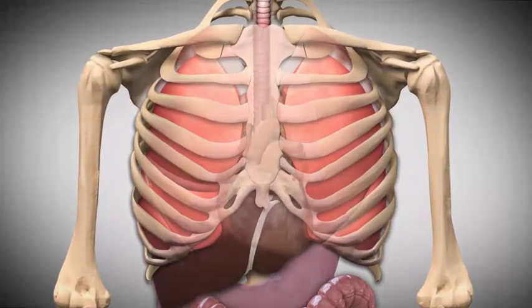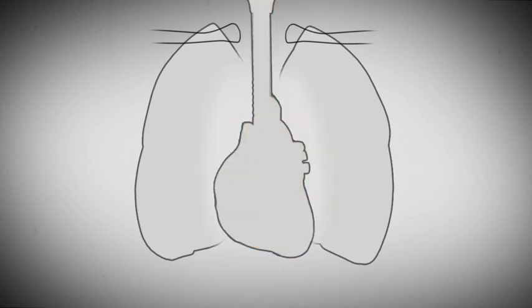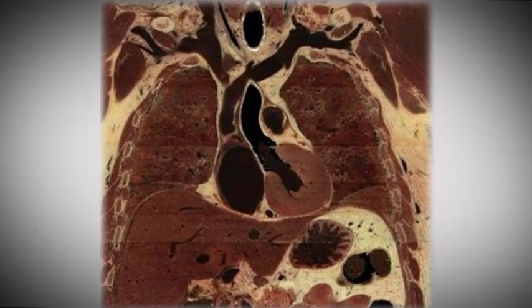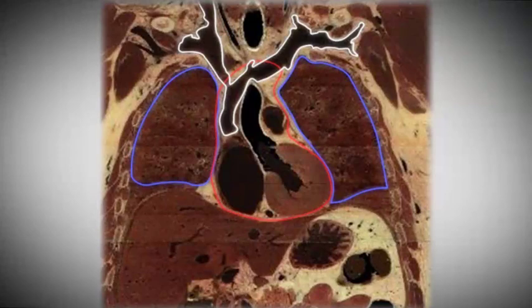Shown in this schematic diagram of the chest are the margins of the inflated lung and the pleural cavity, the medial heads of the clavicles, and the central silhouette including the heart and the great vessels. Shown in this coronal section of the chest are the pleural cavity and the inflated lungs, the central silhouette that includes the heart and the great vessels, and the brachiocephalic vessels coming down from the neck and the arm on both sides of the chest. The clavicles would appear here in a radiograph or in a coronal section that was farther forward or more anterior.